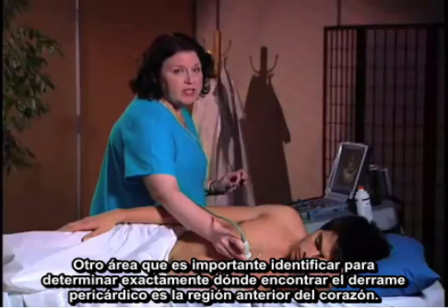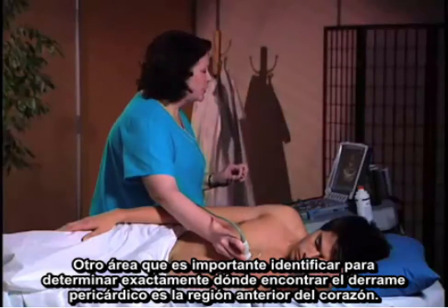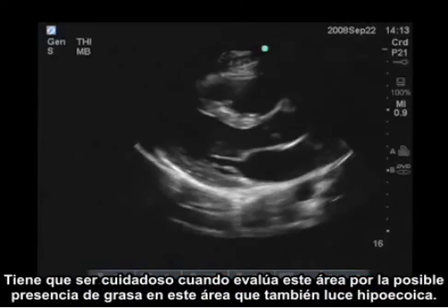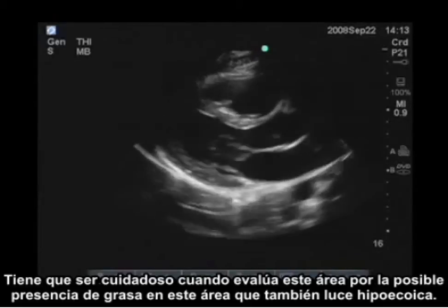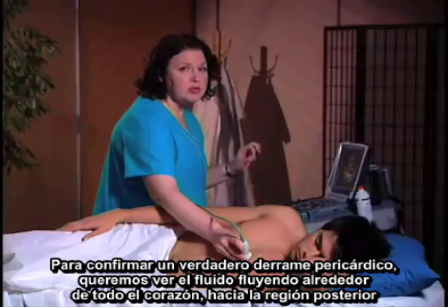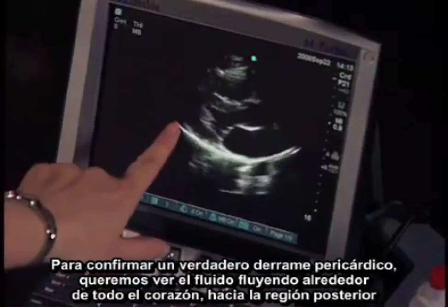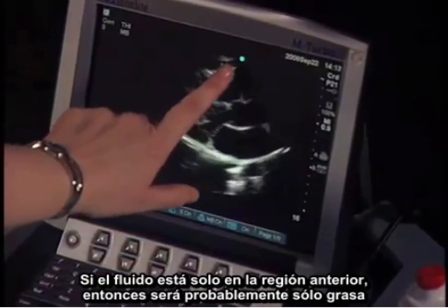Another important area to identify to determine exactly where the pericardial effusion is, is the anterior aspect of the heart. You have to be careful when evaluating this area because there could be a fat pad that appears hypoechoic. For it to be a true pericardial effusion, we want to see the fluid wrapping all the way around the heart to the posterior aspect. If it's just in the anterior aspect, it's probably just a fat pad.